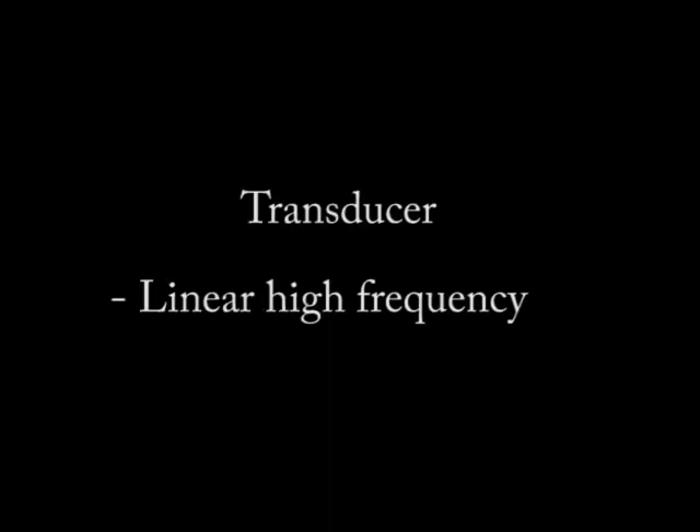With the transducer, because this structure is superficial, I'm often using a high-frequency linear ultrasound probe to get the best resolution.